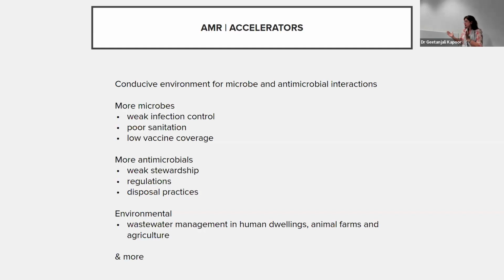Even if you just get age and gender and the resistance rates, that itself is a lot to get. But again, the AST data that you're getting should also be done following all quality guidance. Many times you don't even get that. You may have issues with the kind of data the lab is giving you, especially if the data is retrospective. You have no way of cross-checking or getting it rechecked. You have to go by what's given.